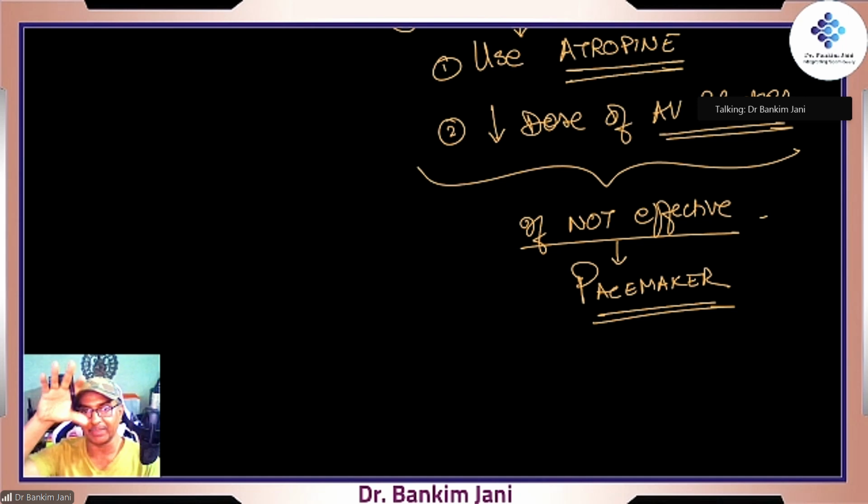One which will be affecting the upper heart, and there are specific pacemakers which will be affecting upper as well as lower. We'll be discussing pacemaker as a separate topic, where I'll show you all different types of pacemakers. But that's what we need to do. And in pacemaker selection, which pacemaker is to be selected purely depends upon the condition of the heart.